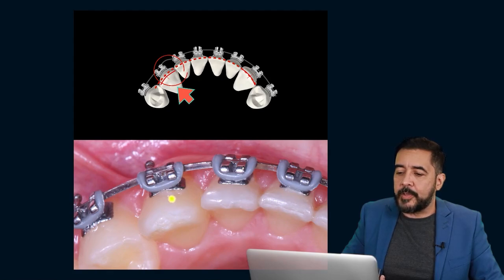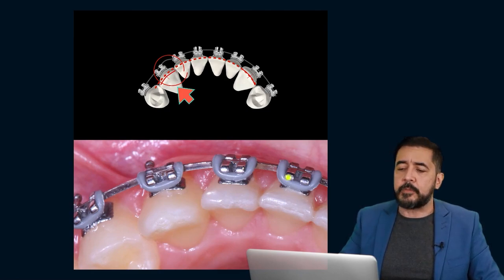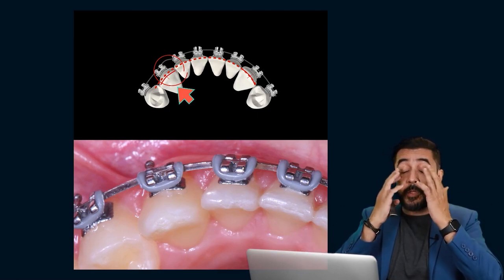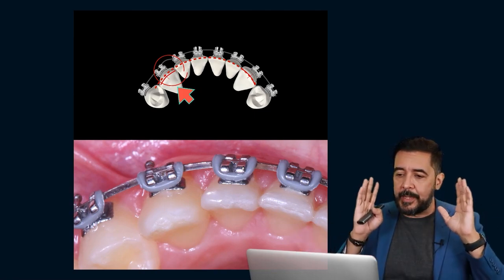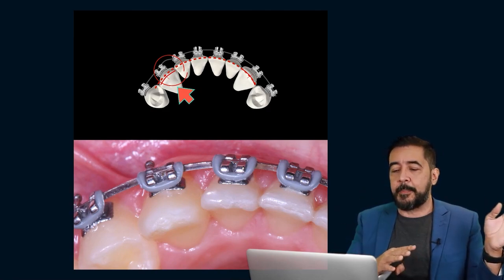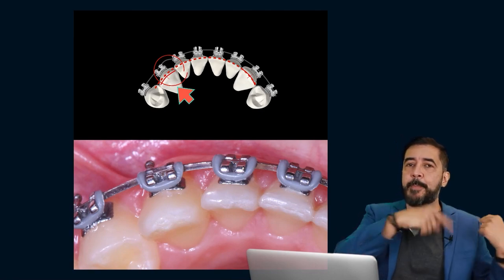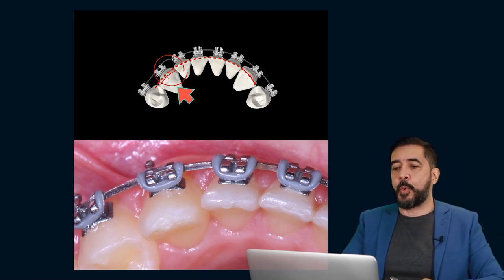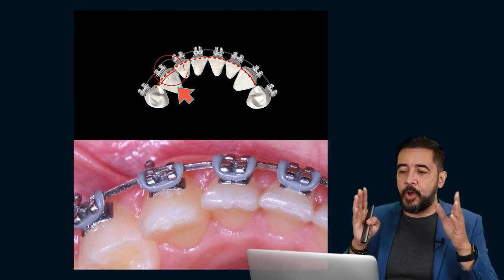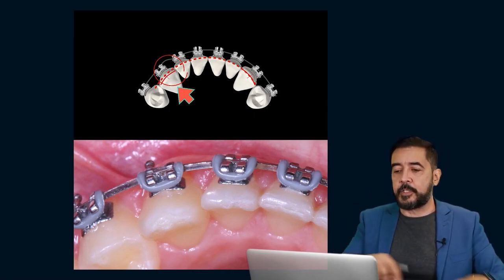So what happened was a not soft alignment between the lateral incisor and the mesial part of the canine. So of course you can correct this. Of course we can do bends for that or rebond the bracket. But if we anticipate this kind of mistake, we can do a smoother treatment, without the need of going backwards in order to correct something that was not necessary to correct if we had this kind of care in the positioning of the canine related to other brackets.